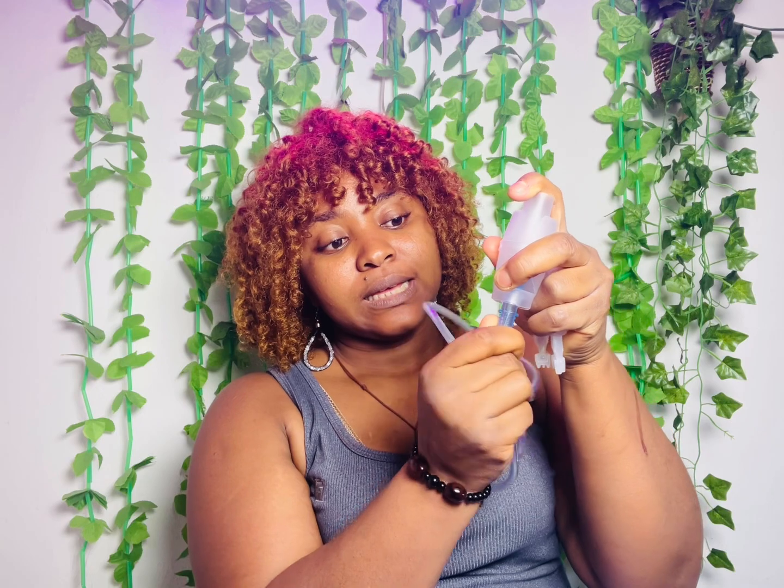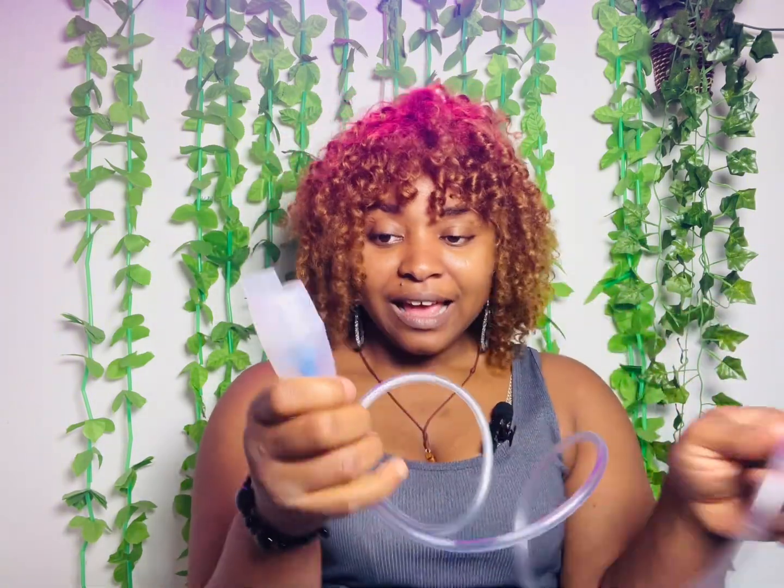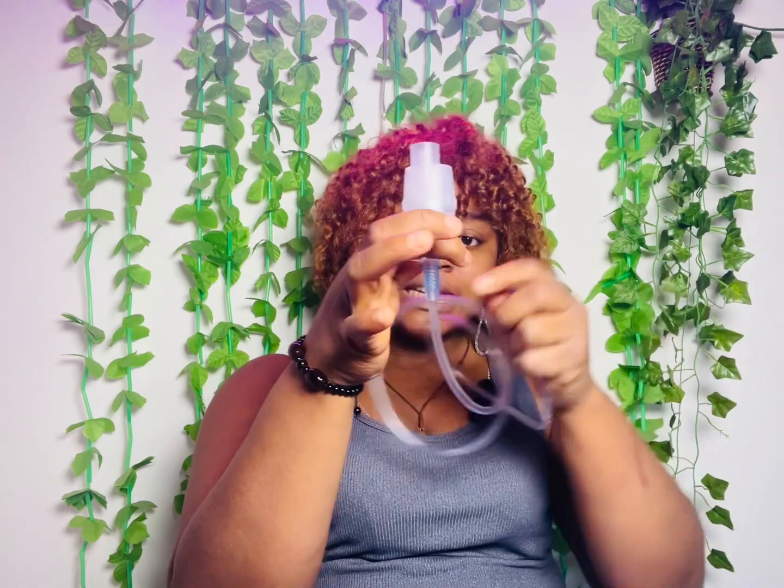When you're done covering, you take the end part of this tube and insert it underneath like so, holding it. Remember, we have something inside. I didn't put it, but you ought to put one of those medicines inside. And then you put it underneath. Now this is the machine itself.